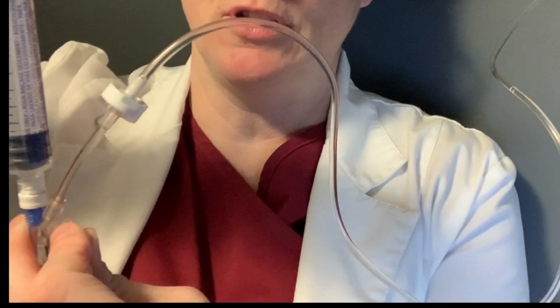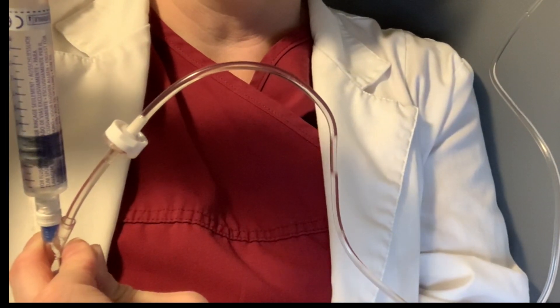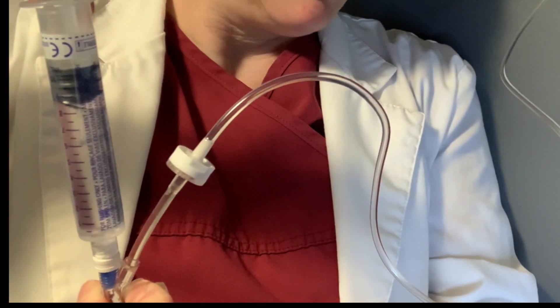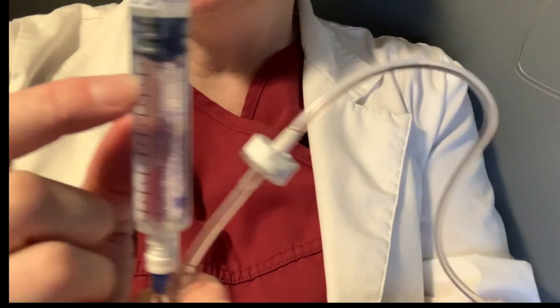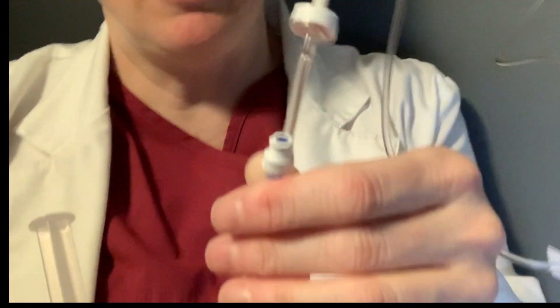Watch as the air bubble comes into the syringe. I've removed all of the air — you can see it inside the syringe. Detach, and the line is now clean.